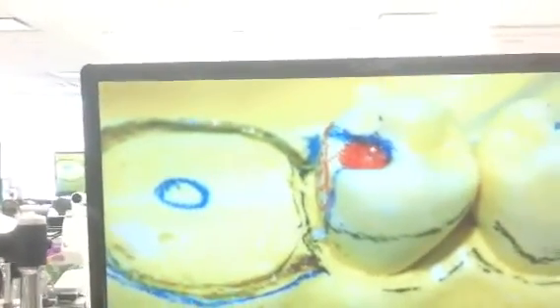That's perfectly fine. You can have a little bit of acrylic that extends out beyond also, especially if you're using a braided post. Because a braided post is actually held in place, the denture tooth will be held in place with denture acrylic. So on a braided post, you will normally have a little acrylic flange. I was always taught if the acrylic does go over the metal, then the acrylic should go all the way to the vestibule. Dr. Smith does not feel that way, so there's been a little controversy on that.